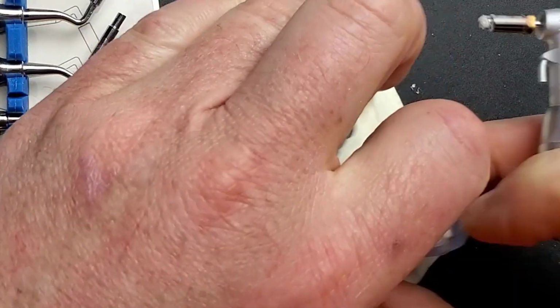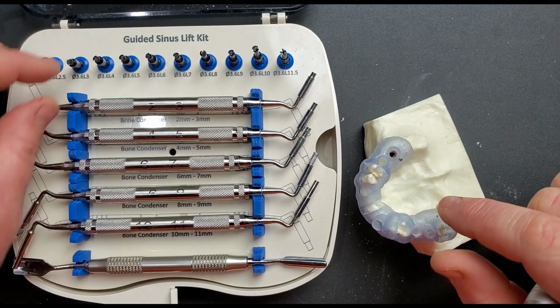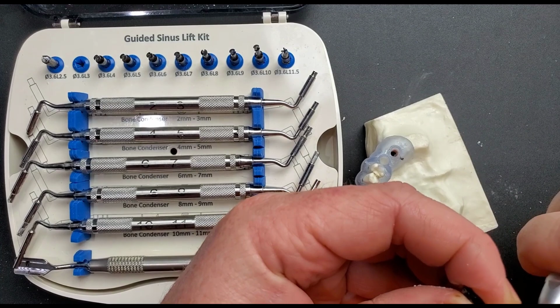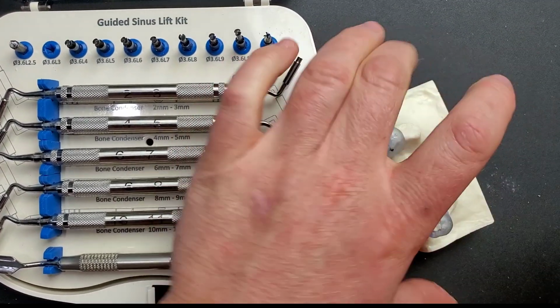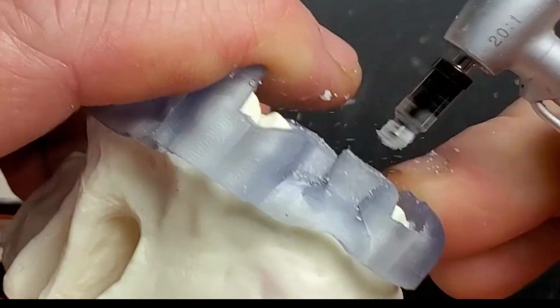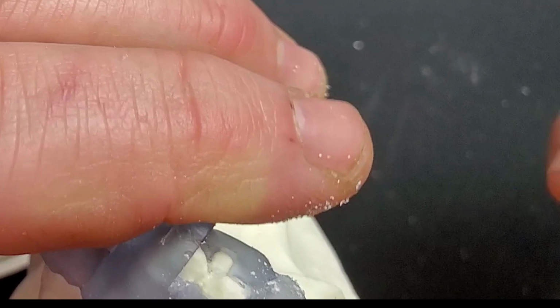Okay, so the drill has bottomed out on the stopper, which is on the drill, and now we switch over to the safe-ended sinus burrs. So now I'm going to grab the 3 millimeter sinus burr. We'll go in, take it to depth. Now, since you're only going in 1 millimeter increments, this should go very fast.